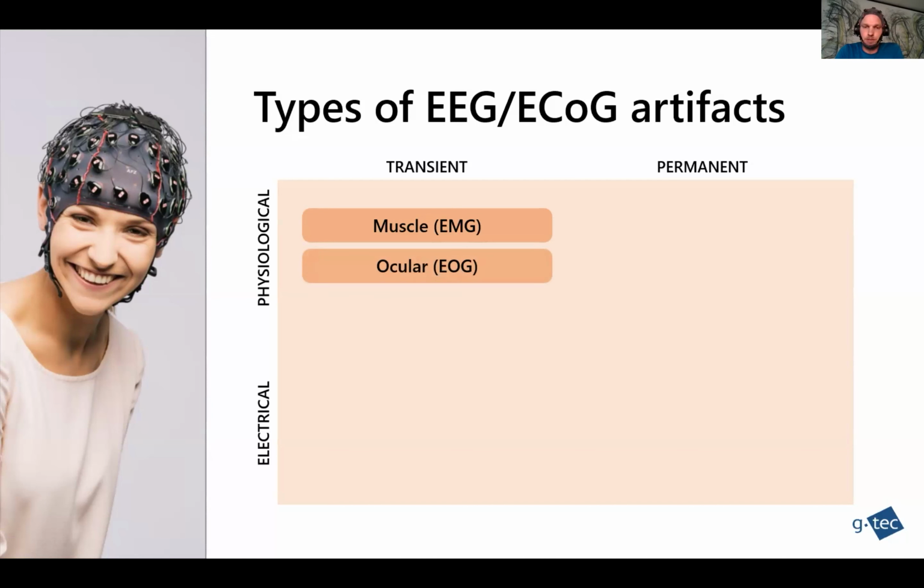Then there is eye movement, EOG, or ocular artifacts. This happens when you are blinking, like this, or if you're moving your eyes like this. You cannot avoid blinking. This always happens, and especially in the frontal channels, you have blink artifacts all over the place. But luckily, they do not occur permanently unless you're provoking that, but every once in a while. That's why they are considered transient artifacts.